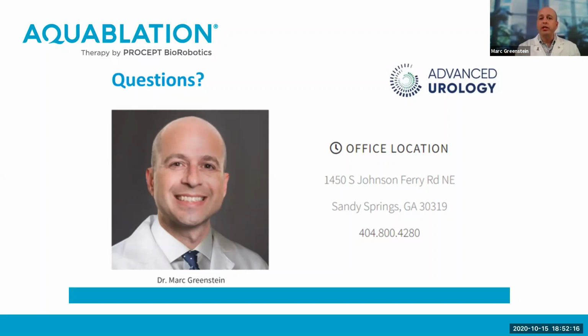Next question is, what about ejaculation? So like I said, this is probably the only surgery out there that is with a camera, that is resective, that can spare the ejaculation. Why? Because when I showed you that map, or that video of the prostate, and I map it out, it is showing where the ejaculatory ducts are. And I can tell the ultrasound, the robotic technology, to spare that area, to spare those ducts, so that the ejaculation is saved. And let's be honest, when you have a man who is very in tune with their sex life, they're going to want to make sure that their erections and their ejaculations are spared with prostate surgery.